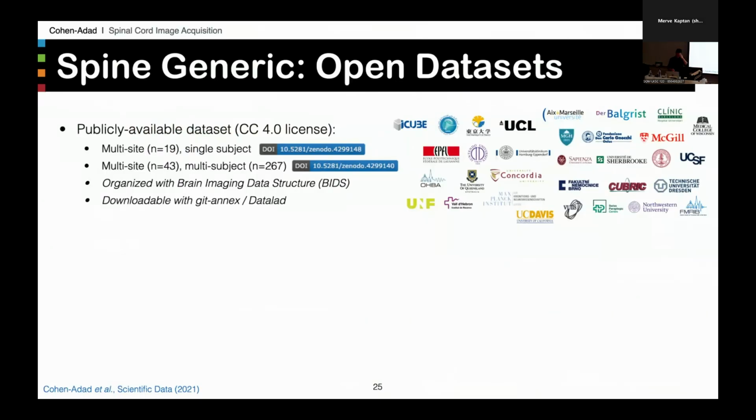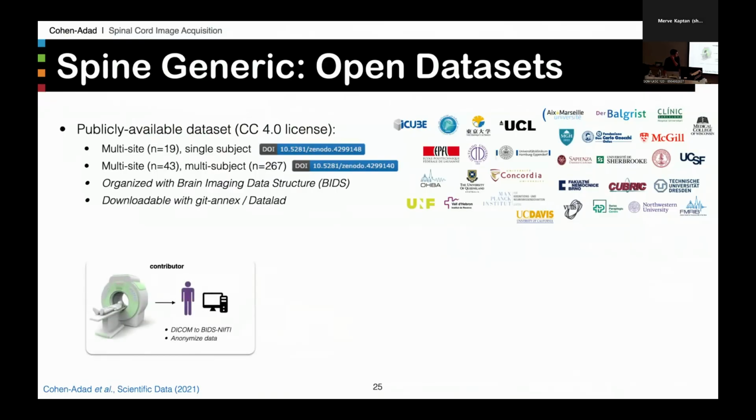Okay, good. Okay, so we asked multiple groups to use this spine generic protocol, and then come up with data sets that was organized using BIDS standard, naming standard.